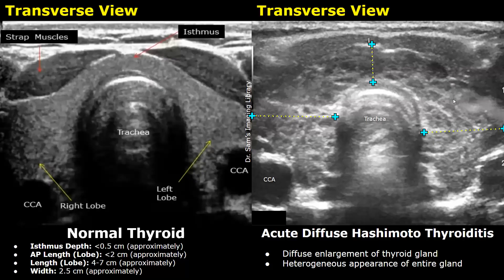In acute diffuse Hashimoto thyroiditis, there is diffuse enlargement of the thyroid gland. The whole gland will have a heterogeneous appearance — you can see a difference in appearance of the thyroid, as the echo texture is heterogeneous.